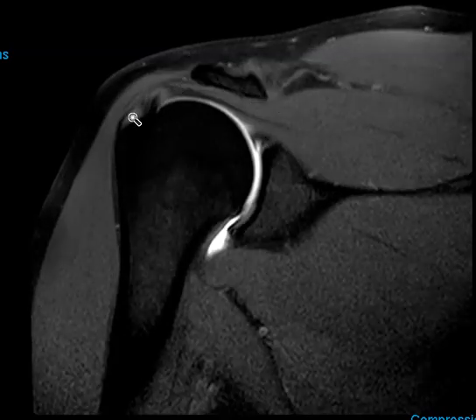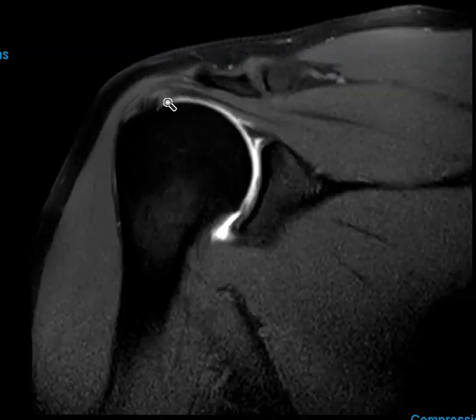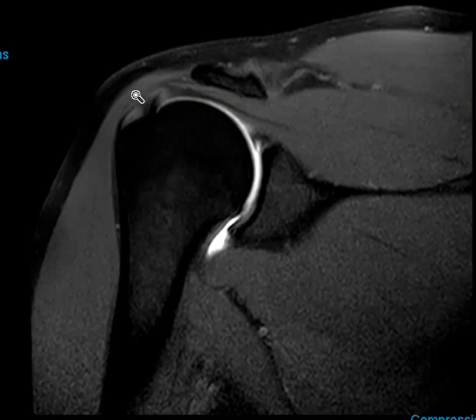Also, the rotator cuff that goes around here — if there's a torn rotator cuff, a partial tear, or even a full-thickness tear, we'll see the white contrast going up into the tear. If it's an undersurface tear or a full-thickness tear, the contrast will extravasate out into the subacromial subdeltoid bursa. This is, again, an MRI following arthrogram, showing the contrast in the joint.